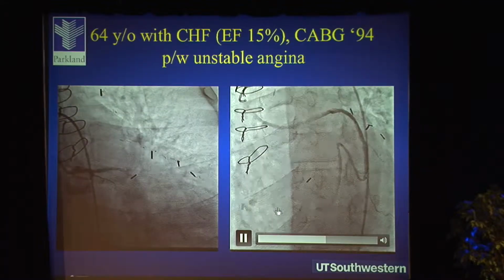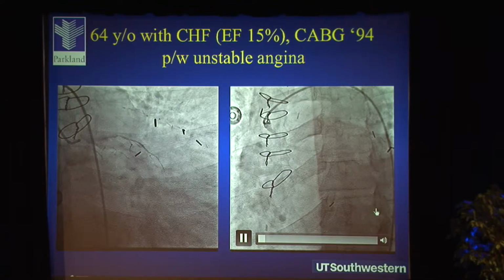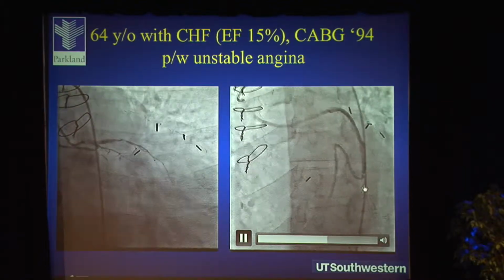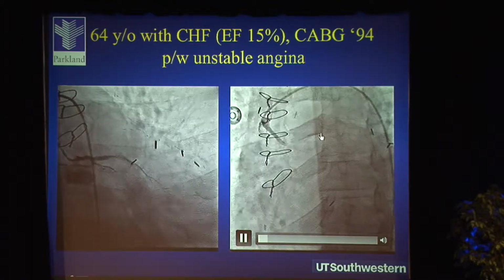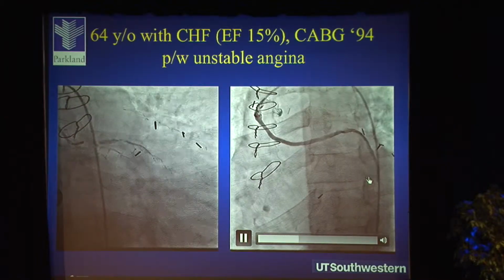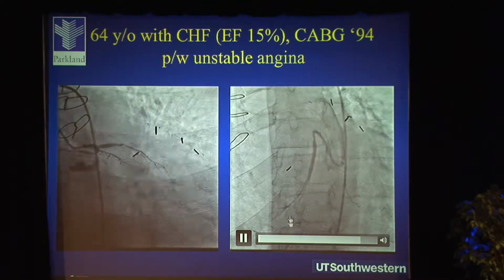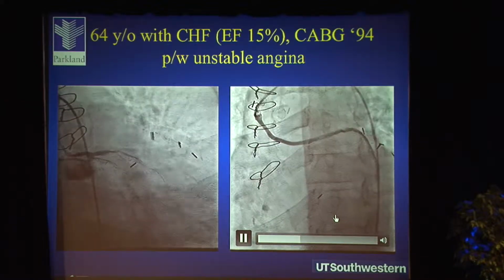and if you look carefully, he has an anastomotic complex lesion, and this anastomosis is onto an obtuse marginal vessel. The vessel distally is a little underfilled as it is distal to it being tented up by the graft. And if you look carefully, and this is important in this case, this vein graft backfills the AV groove circ, which goes on to supply some of the posterolateral wall here.